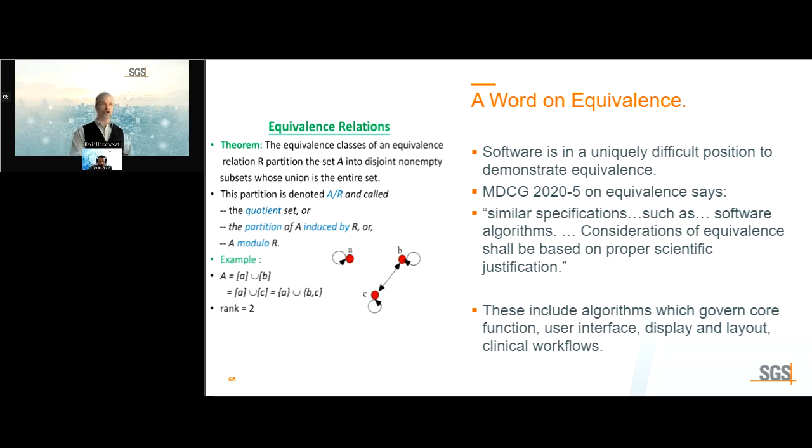You may need a functional test, which is a valid method of proving equivalence between two softwares. You may need a functional test that the output at a black box level is the same. But other things that also are important are user interface displays and layouts. They may impact clinical workflow. So again, it depends on where in the workflow of a patient is your software. Does it directly impact an ongoing surgery or does it not? Will matter a lot for how the user interface is interpreted for usability and GSPR1. Always remember that GSPR1 and 8 are always required to be covered under clinical evaluation assessment. You may choose to add others.